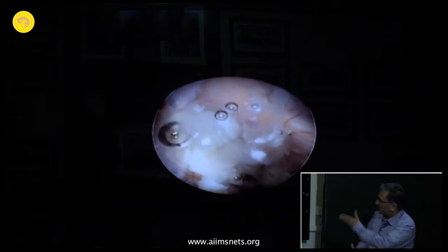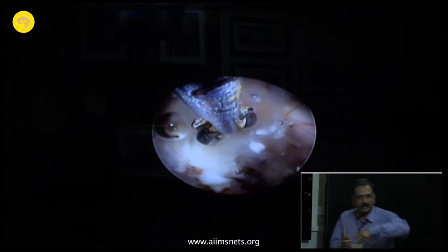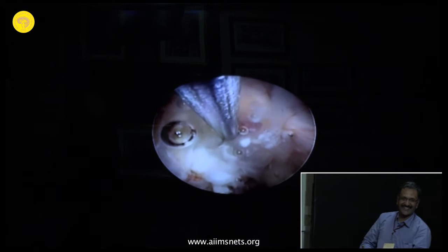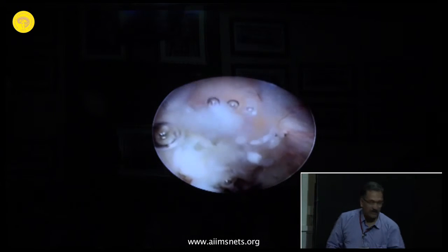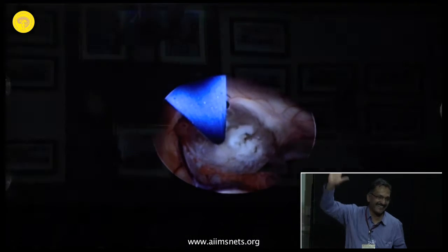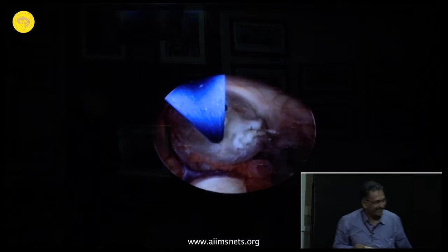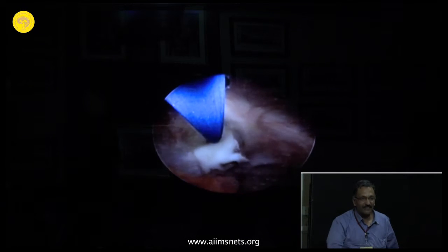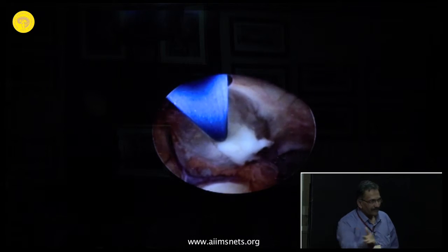It's so thick it doesn't come out. So what do you do? You take a monopolar and cut the secretions with the monopolar, and allow them to float away. You can't catch them and bring them back, okay? So that's what I'm doing: cutting the secretions with the monopolar and allowing them to float away.